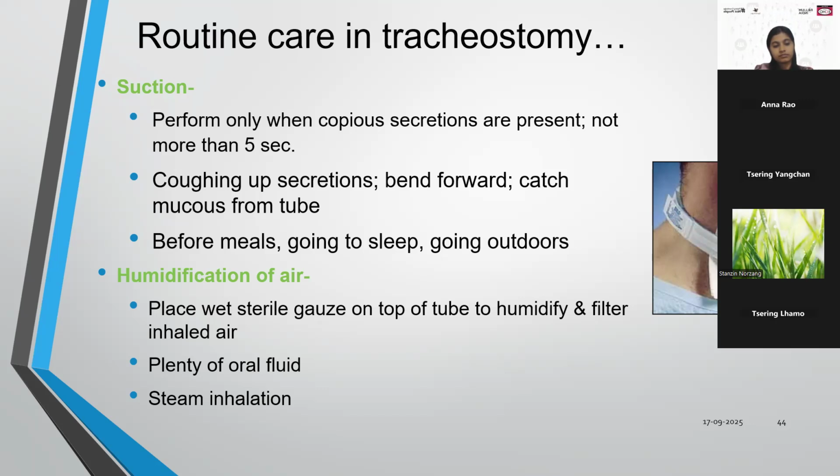While reapplying the new tie, they have to remember to keep one finger gap between the tie and the skin. In that way the tube will not be very tightly tied to the skin. In case of males, they also will shave, so one has to see to it that the hair doesn't fall into it. Keep it covered while doing such procedures.